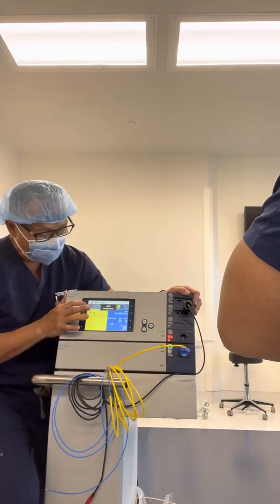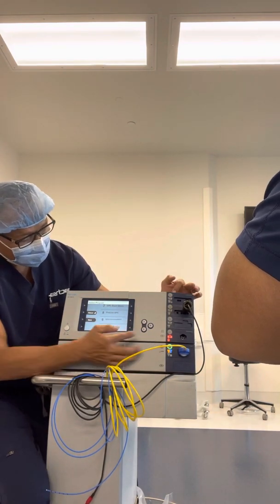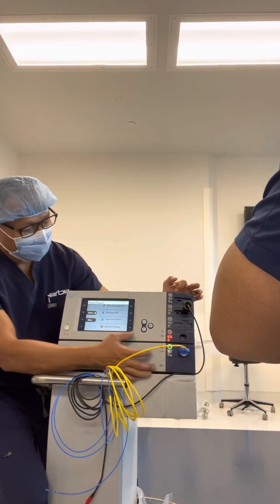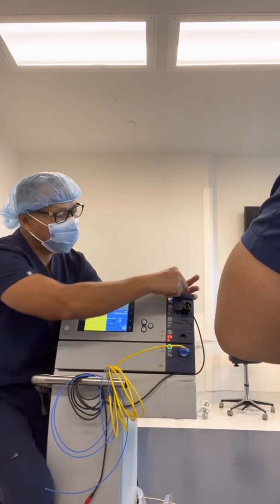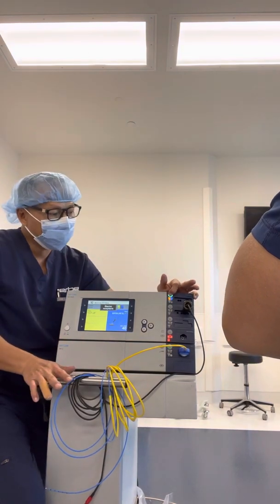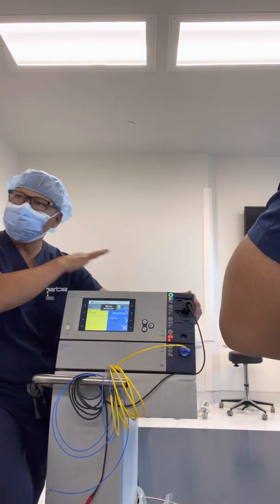Guide program, select — he wants bipolar now. Scroll down, see bipolar pro — selected. The foot pedal jumps up here to bipolar; it plugs directly into the bipolar port. Step two — that's it. Everything is two steps.